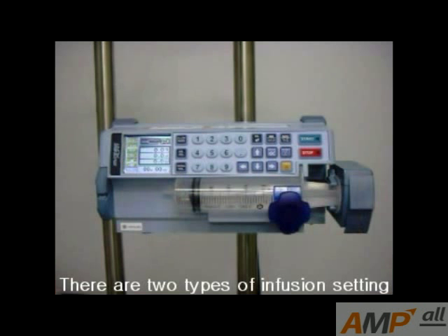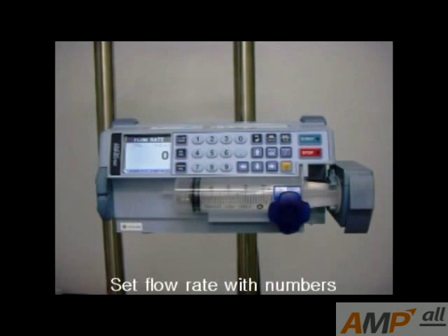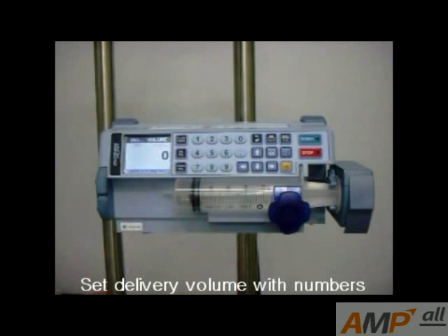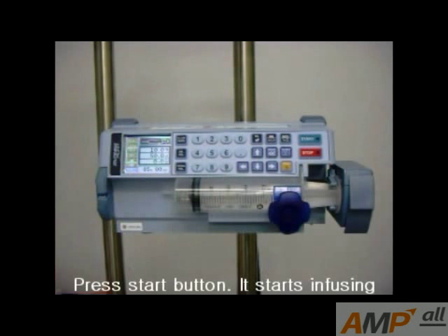There are two types of infusion setting. First, infusion setting with flow rate and delivery volume. Press the flow rate button and set the flow rate with a number. Press the delivery volume button and set the delivery volume with a number. Total infusion time is automatically calculated. Press the start button.